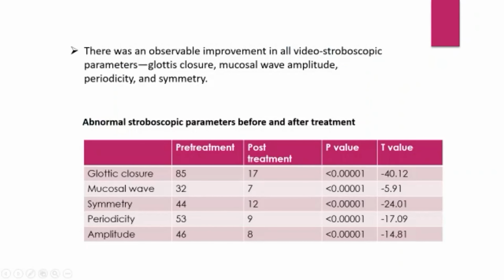So there was an observable improvement in all the video stroboscopic parameters, including the glottic closure, mucosal wave amplitude, periodicity, and the symmetry. In the pre-treatment and post-treatment, all the values had a significant improvement. Next slide, please.